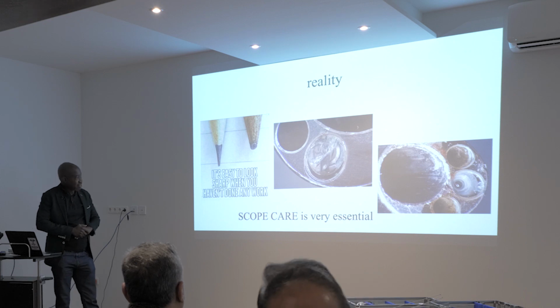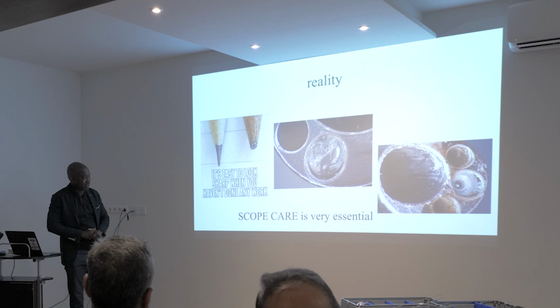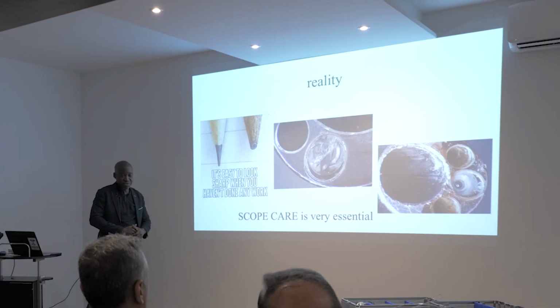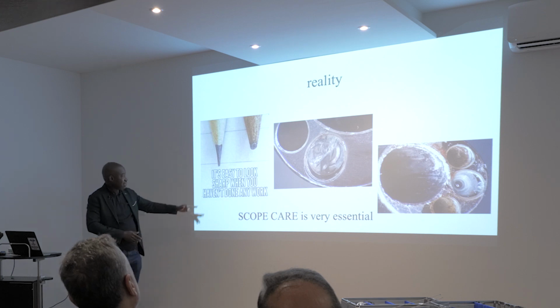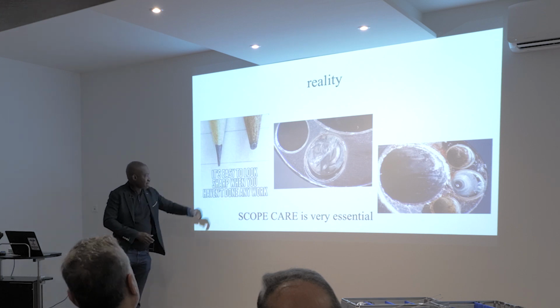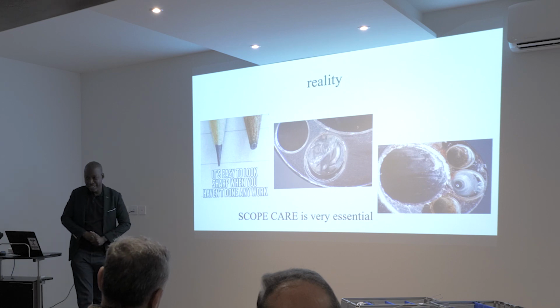And then the reality is, as you are using your tools, you can damage it, and it can get fatigued itself. So we have to know how to take care of these tools. I saw this thing. It is true. It is easy to look sharp when you haven't done any work.